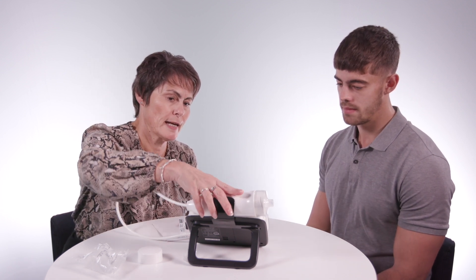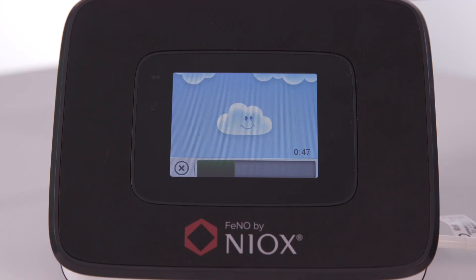We'll just pop that in and we can see the countdown there. So I just want to recap — when you came to see me a few weeks ago, you had quite a lot of asthma symptoms. Could you just run through those with me again, the sort of things you were experiencing? Coughing, wheezing, sometimes waking up at night as well. That's right. And you had a blue inhaler at that time, and you were using that quite a lot.